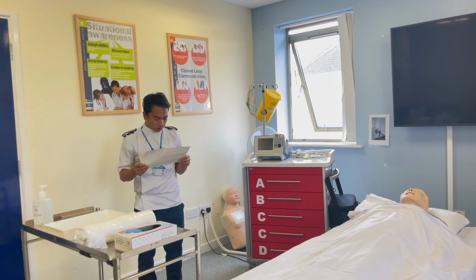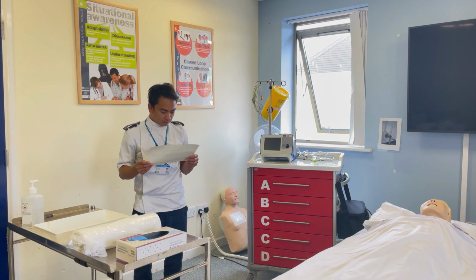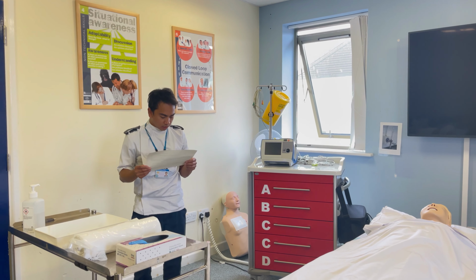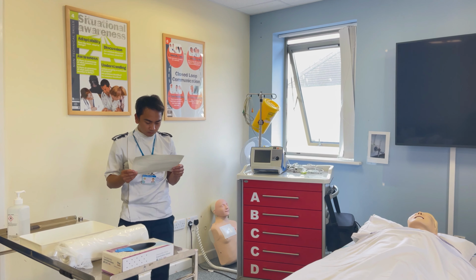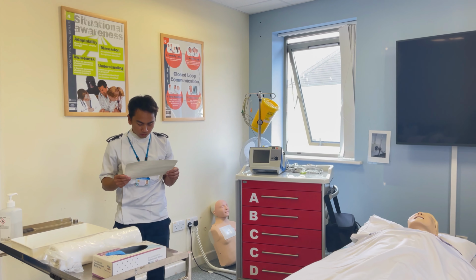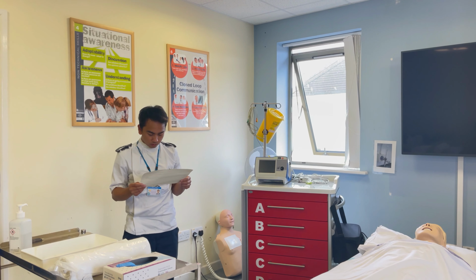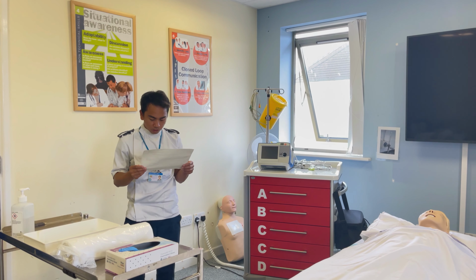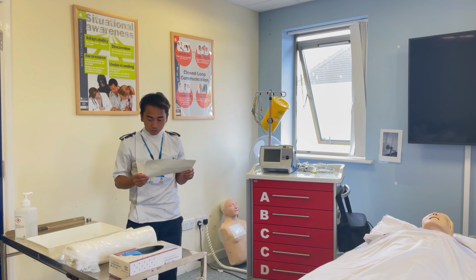Patient details: name House Queen Amina, MRN 18673546. Date of birth, 11th of July, 87. Allergies, none. Signature, Jerome David Salinger, today. Drug, 0.9% normal saline. Flush supply is a 10 ml prefilled syringe. Batch number 593490. Dose, 10 ml flush, route intravenously, time 0800, once daily. Prescriber signature, JD Salinger, today. It's a complete, valid, and legible prescription, so I'm happy to proceed.